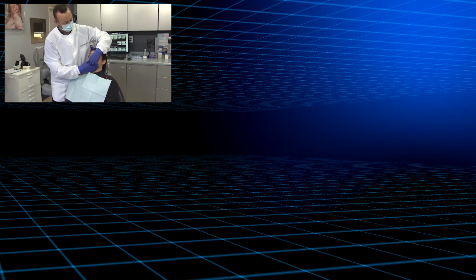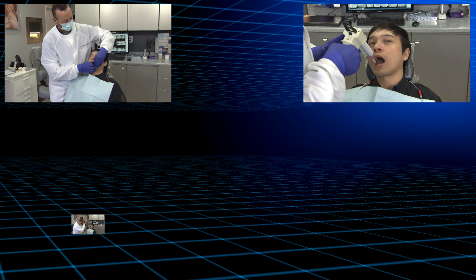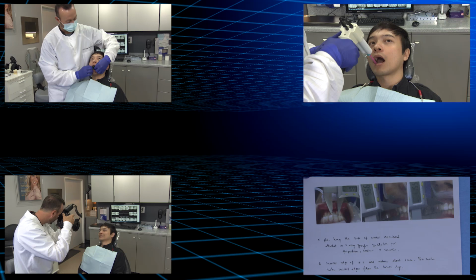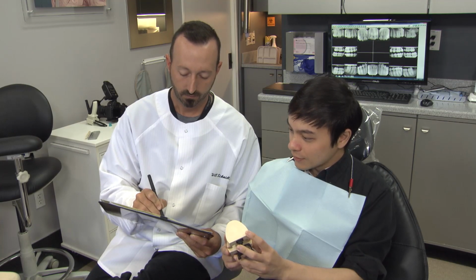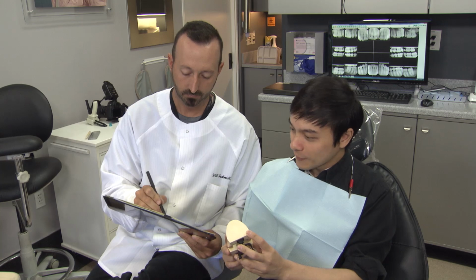Go ahead and take a full mouth impression, upper and lower full arches, include a bite registration, clinical photographs, facial measurements, finish off any additional radiographs, and then include your patient in the lab slip write-up for their diagnostic wax models. So after these steps are complete, I like to schedule the patient out about a week and a half for a 30 to 45 minute follow-up appointment while I send out for all of our diagnostic armamentarium.